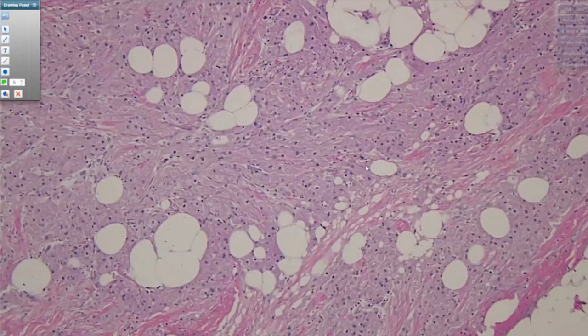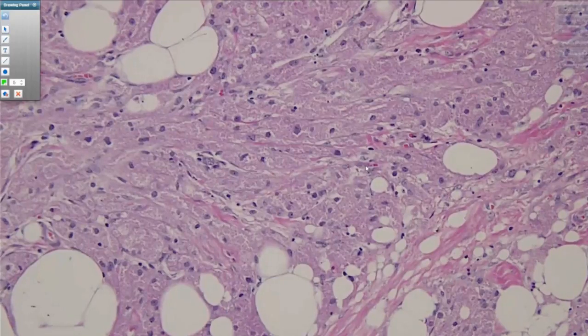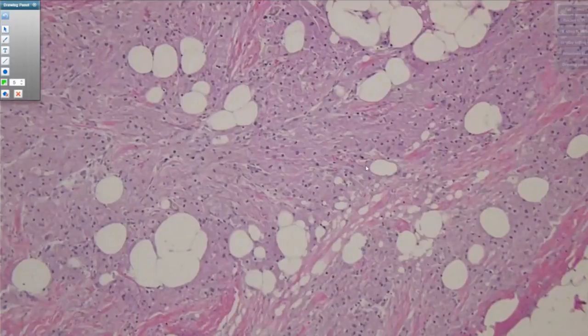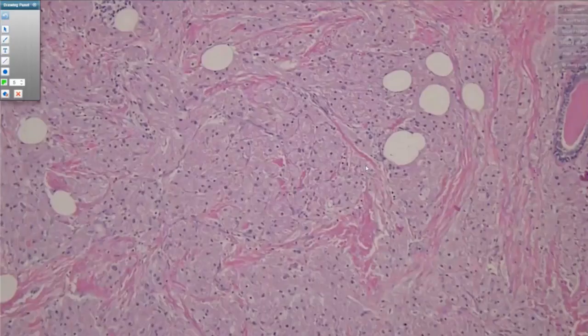Granular cell tumors in the breast label like granular cell tumors elsewhere in that they're S100, CD68, and inhibin positive. Importantly, they're keratin negative, so we can exclude a histiocytoid lobular carcinoma. So although they overlap with histiocytes with the CD68 labeling, it's the S100 labeling that will distinguish them. So this is a nice classic example of a granular cell tumor in the breast. Once you think of the entity, you can make the diagnosis. It's just not the first thing you think of in a breast mass.